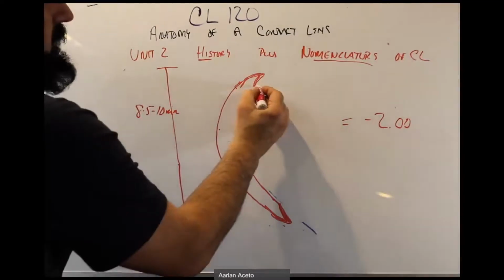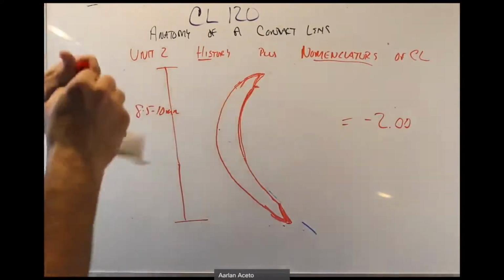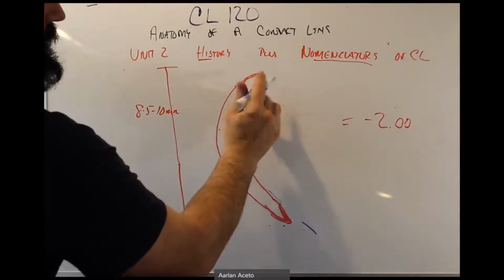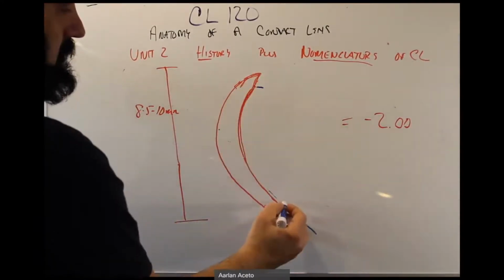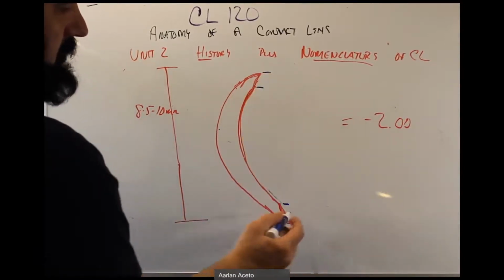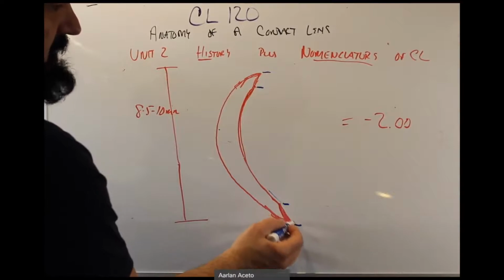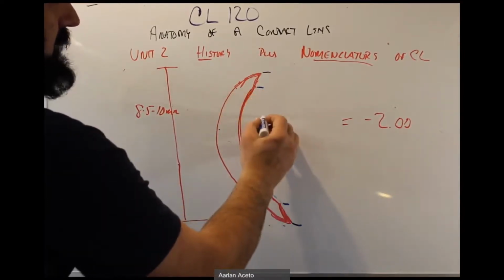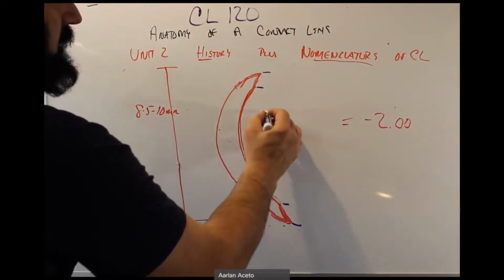This zone here, where we have these little peripheral curves, we call them, right there and right here. Well, here's the whole contact lens, but then we have this little bit that we took off from the side view, and then we have the central part of the lens. So this right here, when we're talking about the width, we call it the optic zone width.